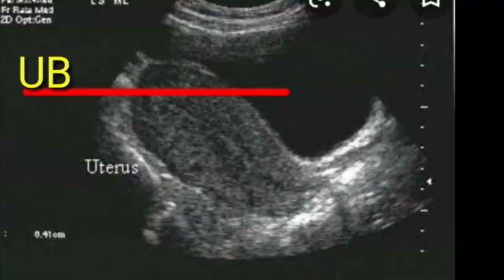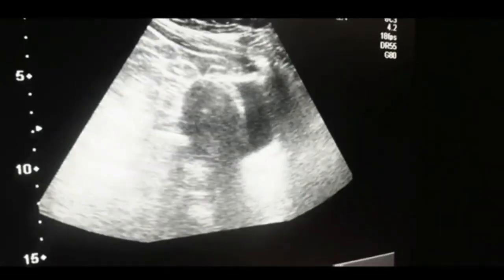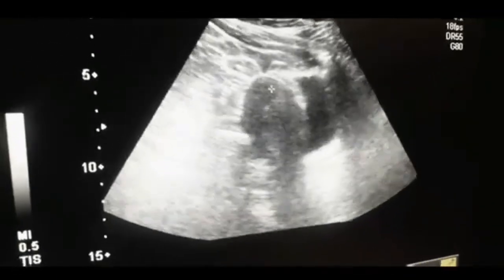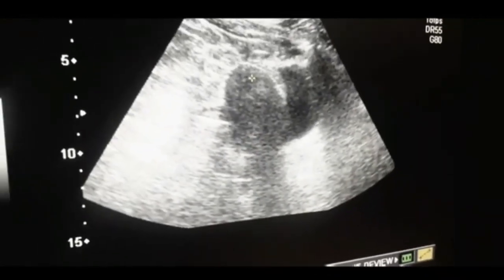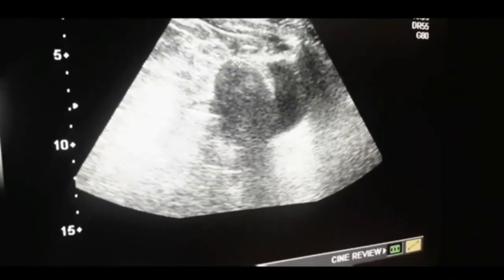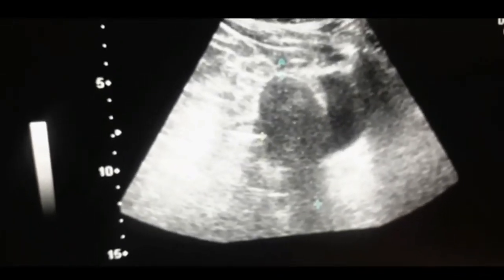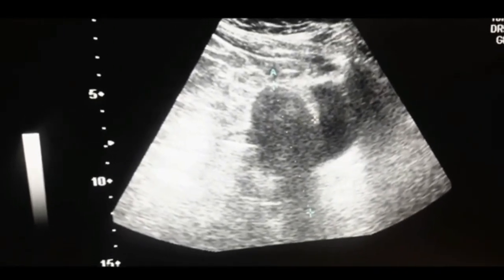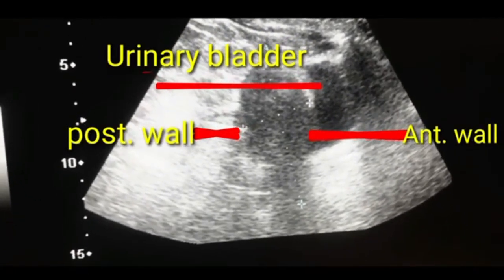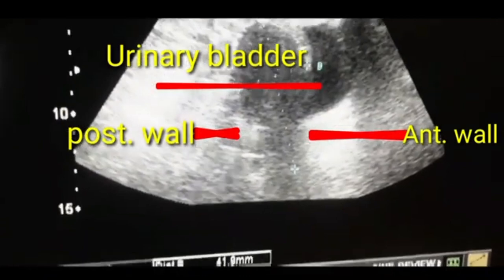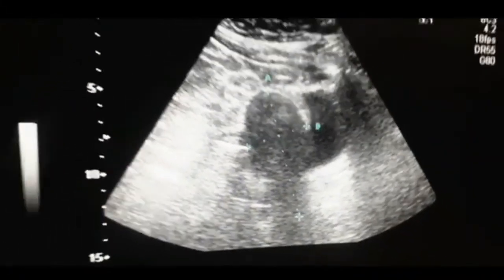The uterus is anteverted and you can appreciate the endometrium as well. This is a live case about the anatomy of the uterus. You can see the anteverted uterus with the bladder in front, the posterior wall, anterior wall, as well as the cervix. This is the craniocaudal diameter and then the anteroposterior diameter of the uterus.